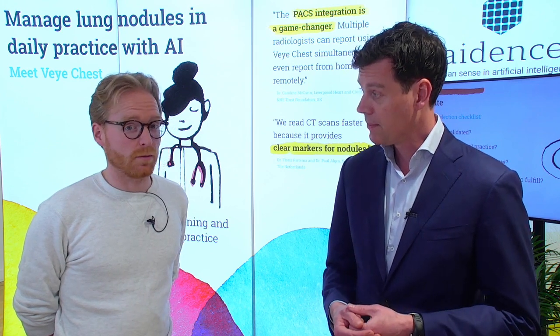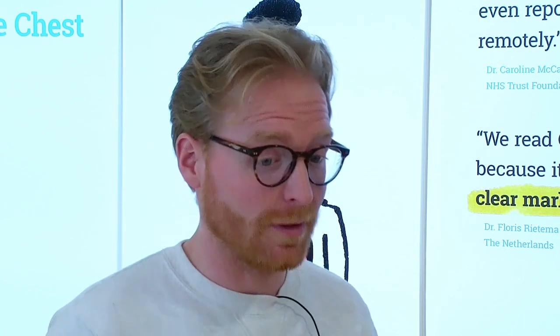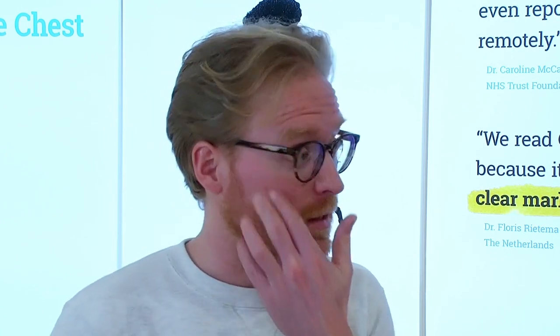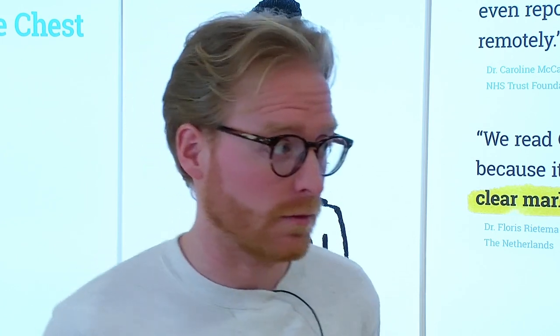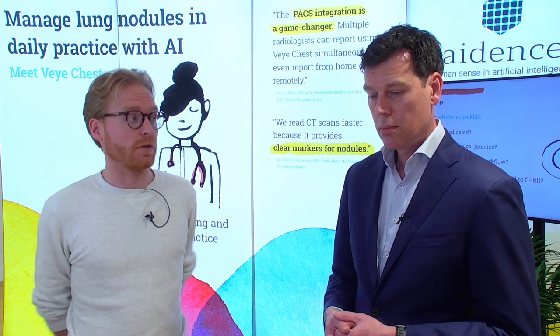For example, is this just for workflow prioritization, or is it a full clinical solution that provides diagnostic decision support information? Those are completely different things with different claims and different types of certification. Exactly.